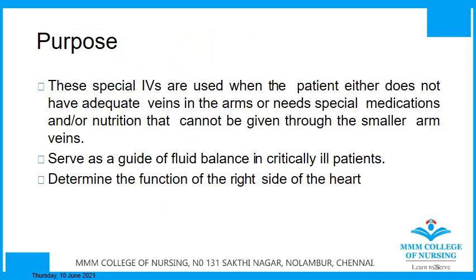Let's see what are the purposes of central venous catheter. The special purposes are, this is mainly designed to use in patients who do not have adequate veins in their arms, or those who are in need of more medications to meet their hemodynamic stabilization, or those who require nutrition that cannot be given through small bore arm veins.